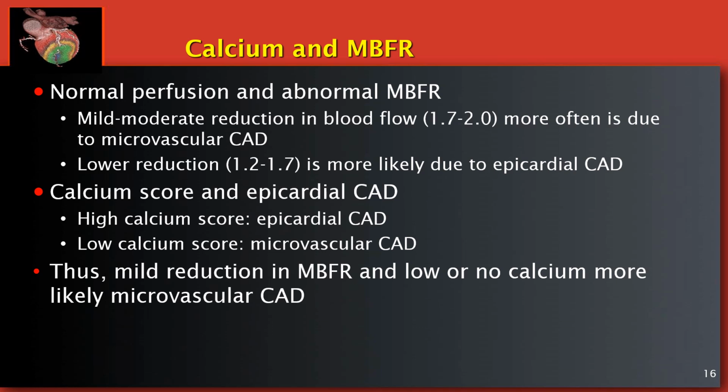Now, I do want to caution, because it's a non-diagnostic study, it should not be done to calculate a calcium score. Your CEDARs and your 4DM, they will have software in there that will give you a calcium score, but it's not accurate when it's a non-diagnostic study.